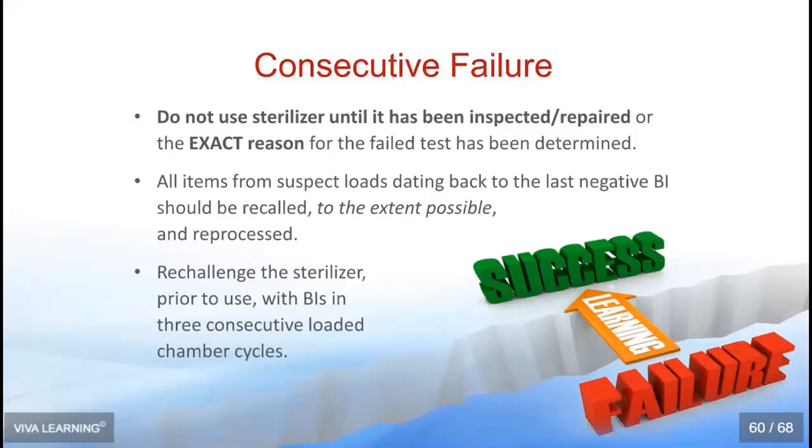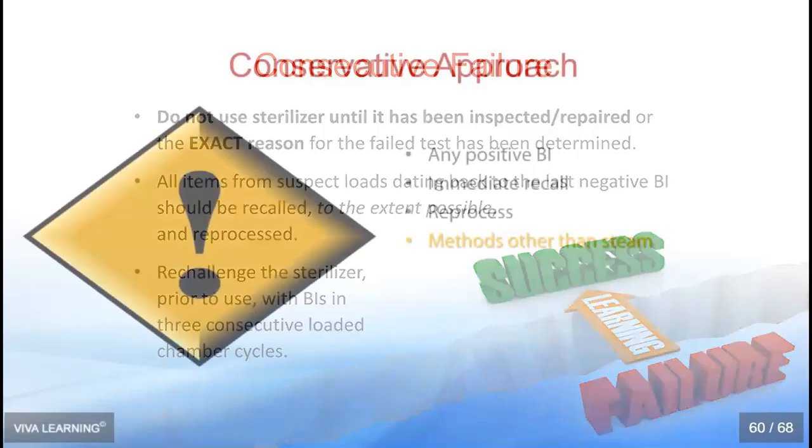And so in your logbook, if we had a failure on August the 30th, and then we had another failure that came back, say we sent it in on August the 31st, and we got it back on September the 3rd, and it showed another failure. On September the 3rd, I should see 3 log entries of testing that's done and being submitted. So that kind of date tracking is very important.